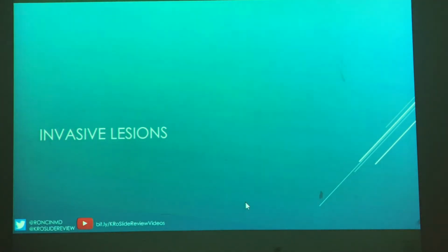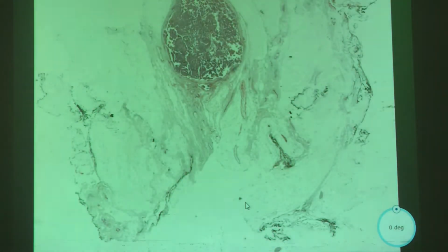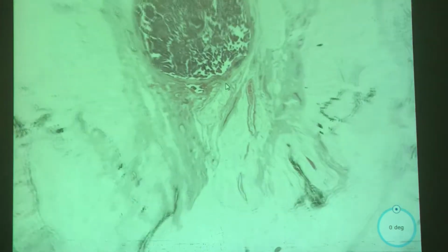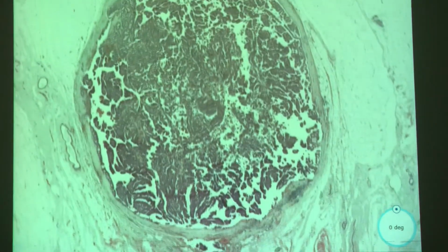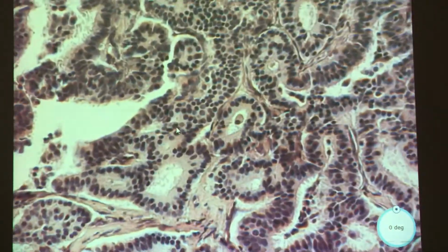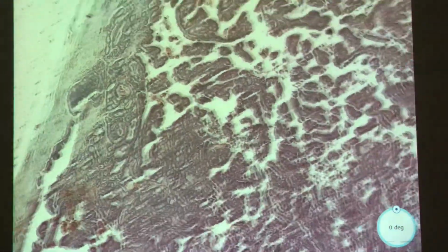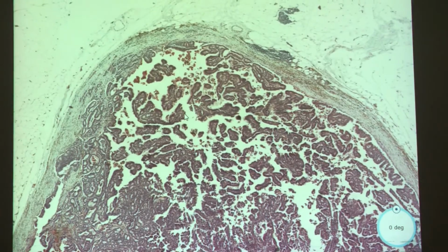Okay, invasive lesions. Well, the first screen superficially at low power looks in situ, but we could be wrong because we're in invasion. Sorry, spoiler alert, yes. So let's go in and see what we're dealing with. So again, it's a sort of papillary configuration. It doesn't look normal, the cells look pretty similar. So it's like a carcinoma of some sort.